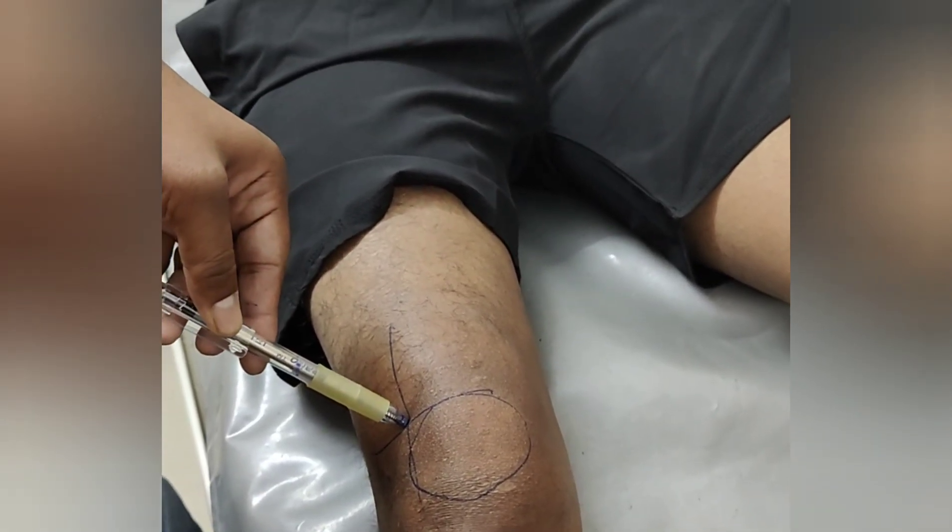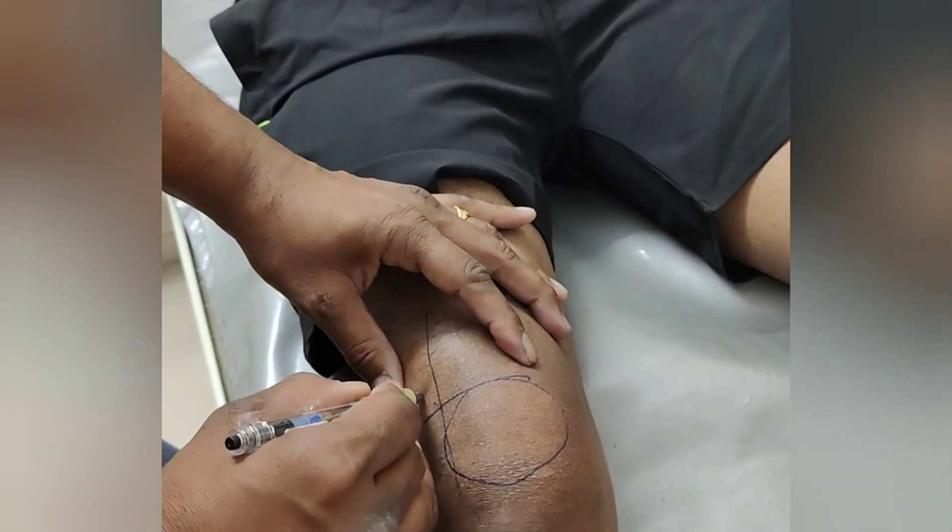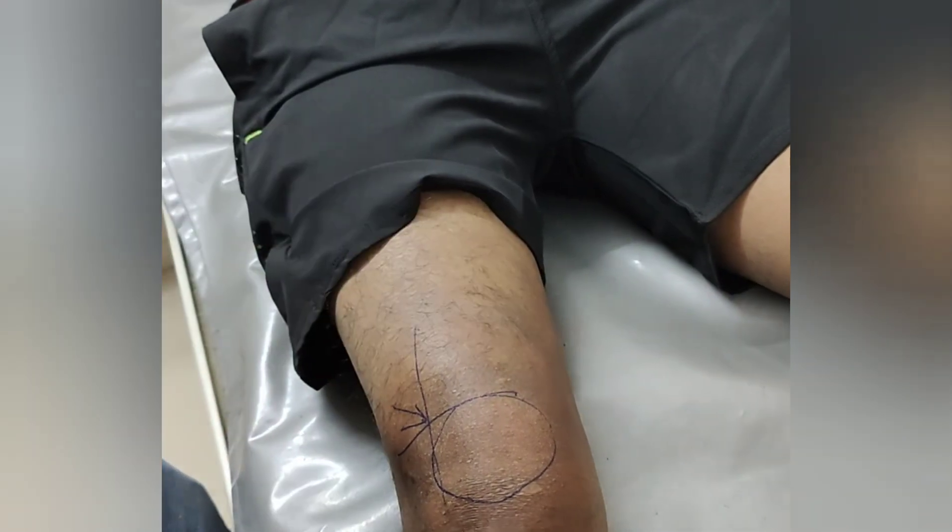At the center of the entry point, make an angle of 45 degrees facing inwards to the patella to enter into the joint.